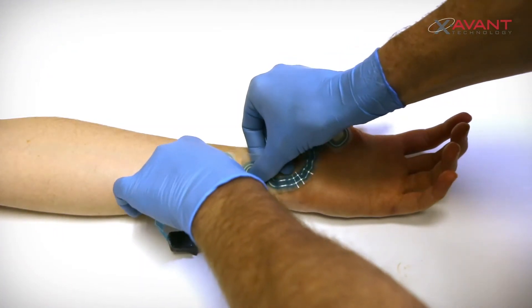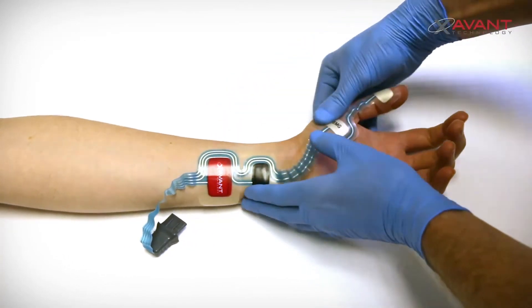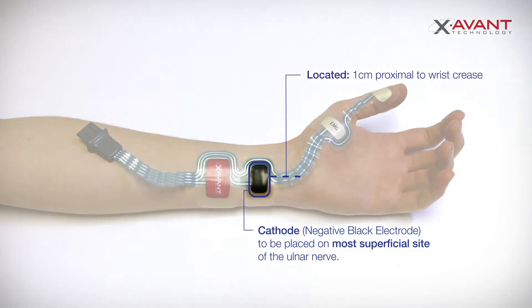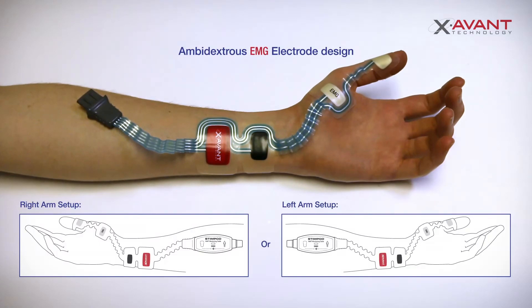Now place the stimulation electrodes on the most superficial aspect of the ulnar nerve, with the cathode or negative black electrode located one centimeter proximal to the wrist crease on the radial side of flexor carpi ulnaris. Note that the ambidextrous design of the electrode allows for setup on either the left or the right arm.